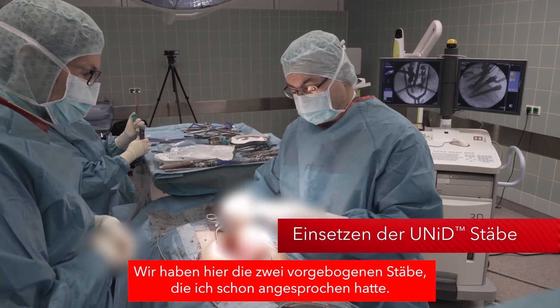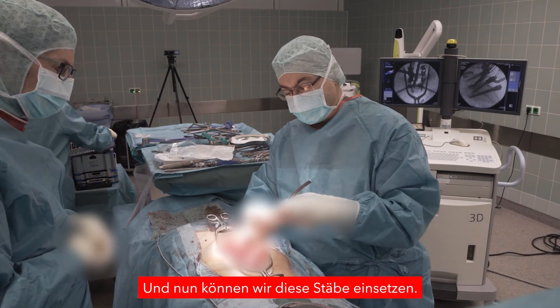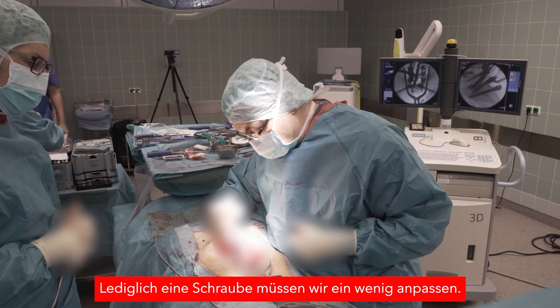Here are the two pre-bent rods we showed you before. This is the situation we have now achieved, and we are going to place the rods. The rod fits almost all of the screws — we just have to adjust one screw.